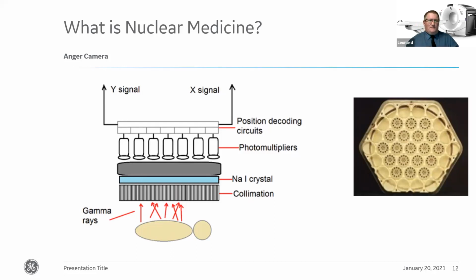The difference with nuclear medicine is we will change that collimator dependent on what type of isotope we're looking at. So if we're doing some of the higher end imaging, like with iodine 123, for example, then we might have what we call a medium energy collimator, which has got a longer septa, which is the length of the lead that we utilize on the system. So that's from this point to this point. And we also change the hole diameter on the system as well to let things through.